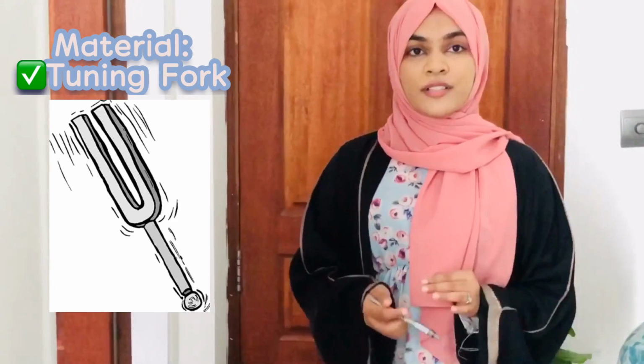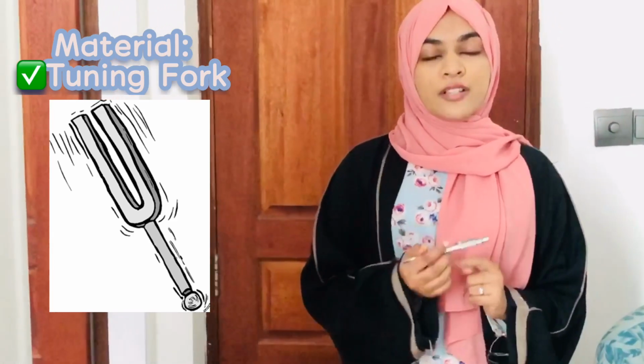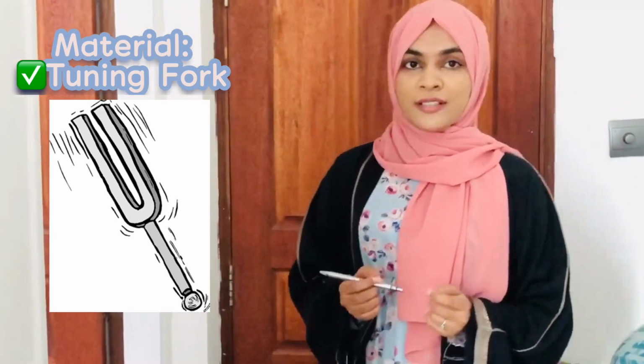Hello everyone, today I'm going to show you how to do the Weber test. To conduct this test, make sure the room is quiet and you have a tuning fork of 256 or 512 frequency. And before you start, make sure you explain to the patient what you are going to do.